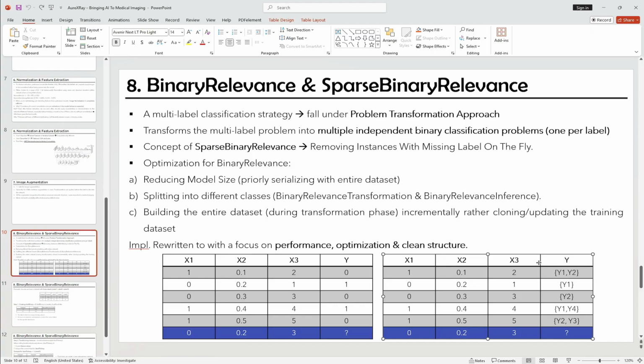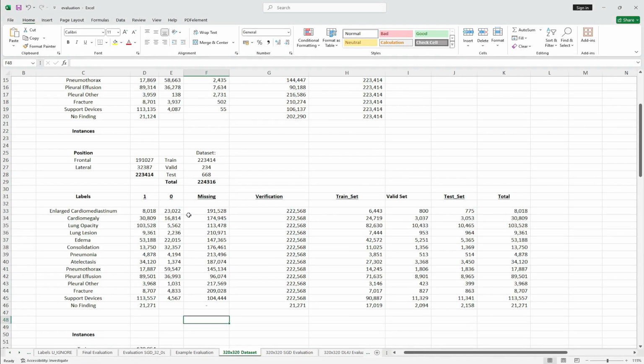For example, in our case of CheXpert, a single chest X-ray image can be associated with multiple findings, which is pretty common with all sorts of X-rays. For example, a single image can be associated with consolidation, pneumonia, atelectasis, etc. In the earlier part, we discussed the problem of label sparsity, where one approach on this CheXpert dataset is to treat all the missing values for a specific label attribute as zeros.